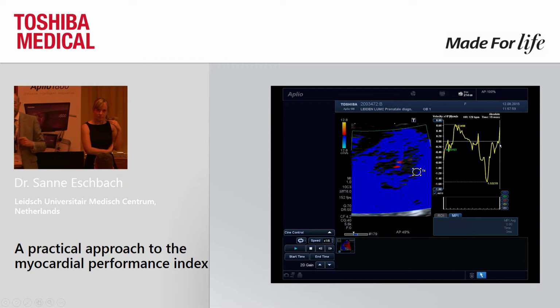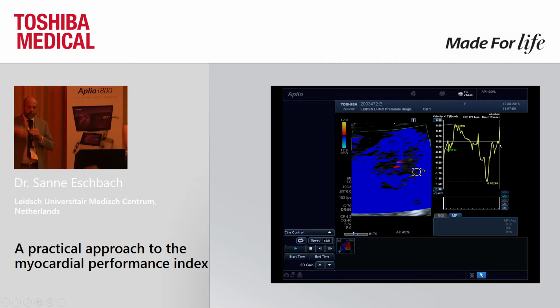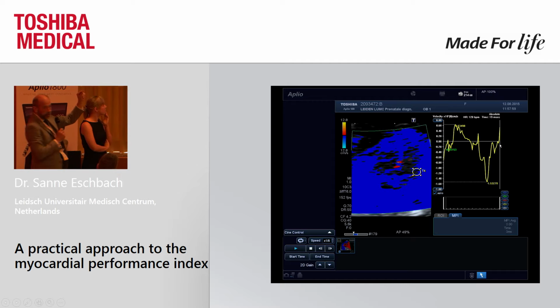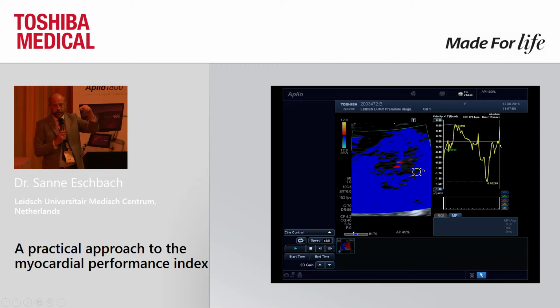Actually, it cannot be better than the frame rate because you use the frame rate for fixing and measuring. As you can see on the display, because you have the interpolation of the data, the effective temporal resolution is higher than 10 milliseconds.